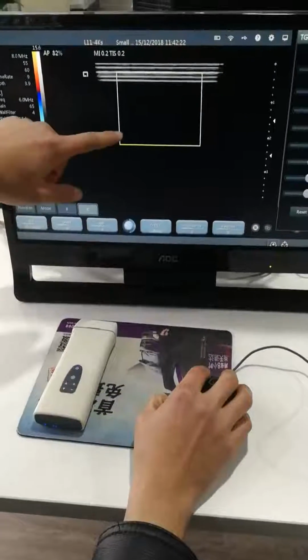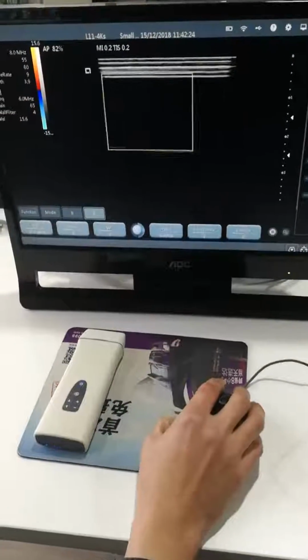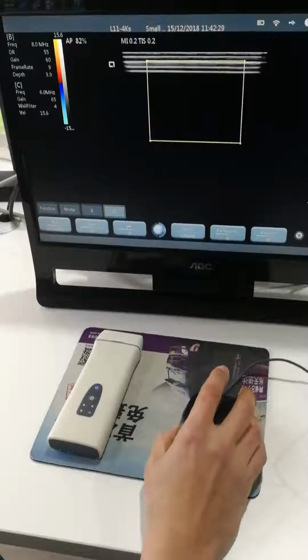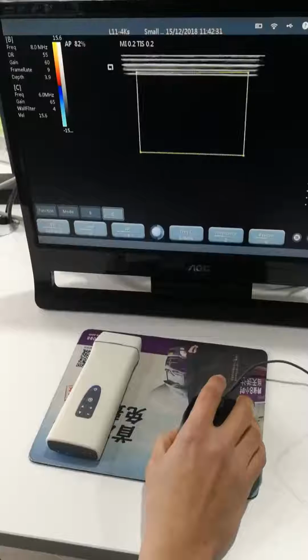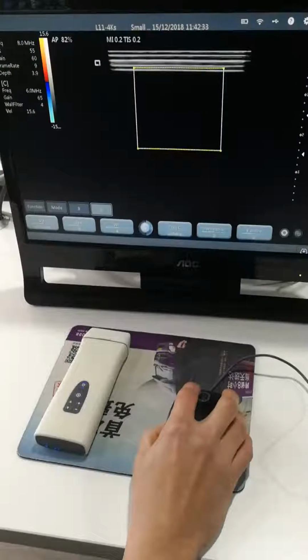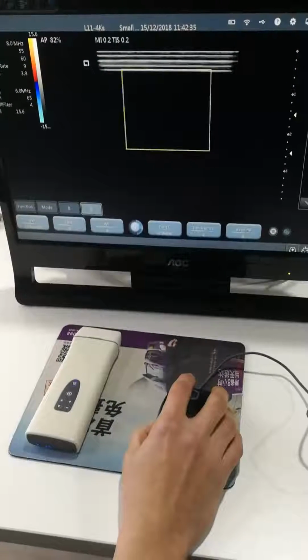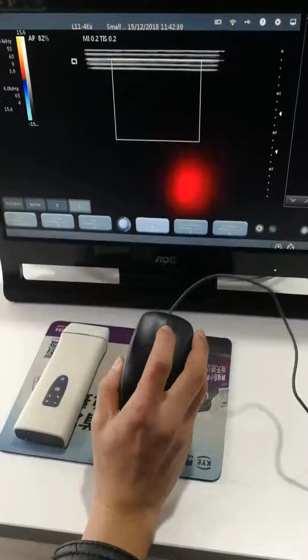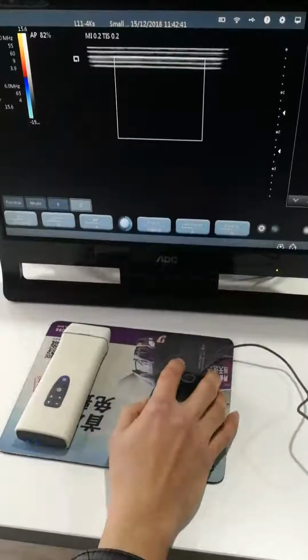And you can see a yellow window. Now you can move it. You left click it. Then you can resize it. And you left click again. You can move to this model too. And then you middle click. You can release the cursor.